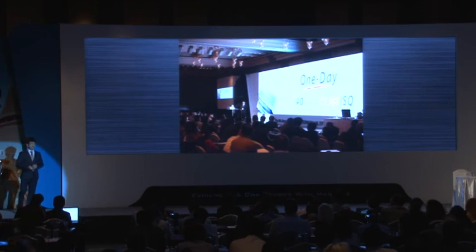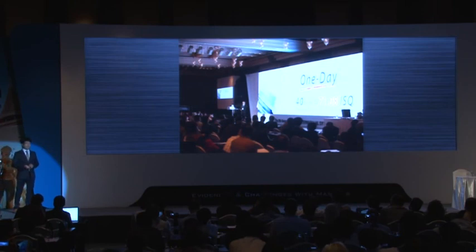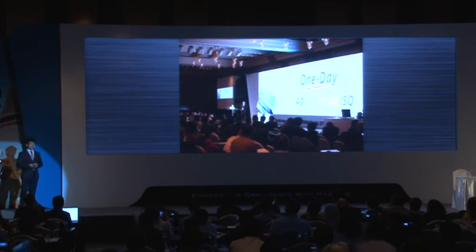40 and 70 or 50 and 80, these are just numbers. These are threshold values for immediate loading of Anyridge that I proposed. You should have your own strict rule for immediate loading. And I think the key point of immediate loading is how to get a reliable initial stability with this special implant system.